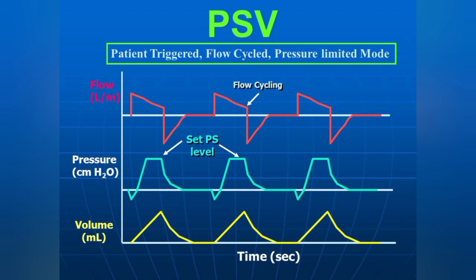After that, PSV mode is pressure support mode. Pressure support ventilation is a mode of positive pressure mechanical ventilation in which the patient triggers every breath and the ventilator supports those breaths to attain the ideal volume or pressure.